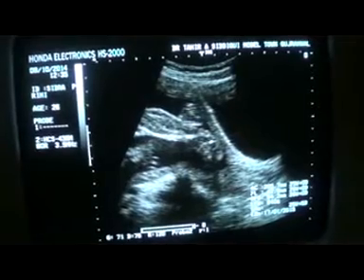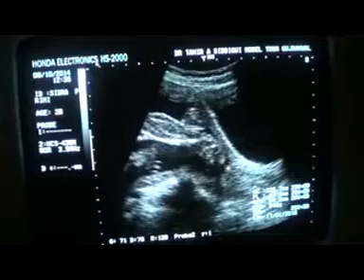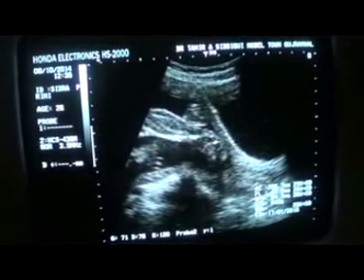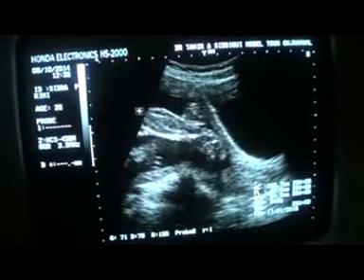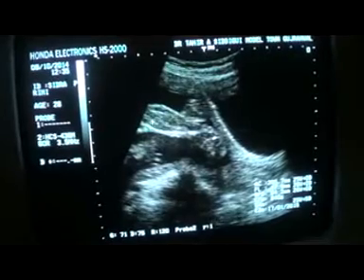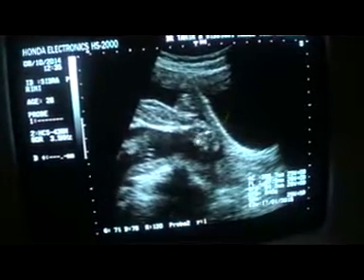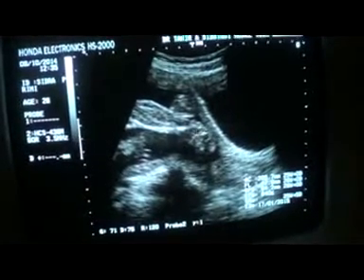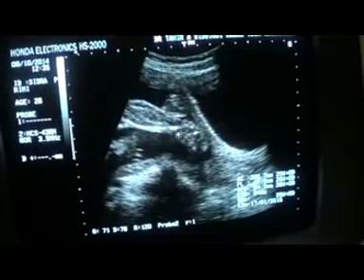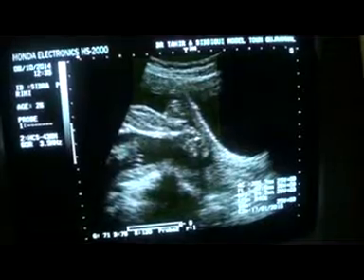Here you see this is the foot again pressing upon the lower uterine segment with closed cervix. The cervical canal is closed. This is the cervix, the urinary bladder, the cervix, the amniotic fluid, and the lower segment. These are the calf muscles. This is the foot, and this is pressing the wall of the lower segment of the dilated uterus, and there is chance of some fetal deformity in this particular case. Thank you very much.